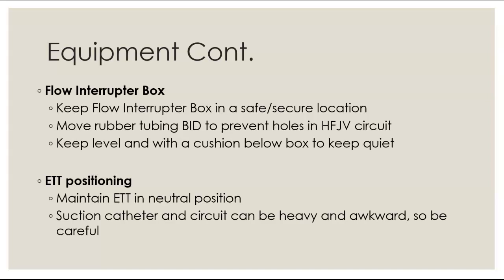The suction catheter and the circuit are heavy and awkward. I'll be the first to admit this, especially when we have an itty bitty. So just be careful. I like to use a burp cloth to help position it where I want it to be. And then I also like little Velcro clips to go around my circuit to help position it and prevent any torquing or pulling that might happen on my endotracheal tube, because that's my priority.